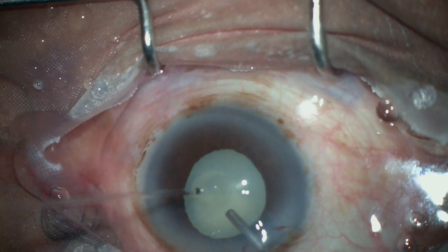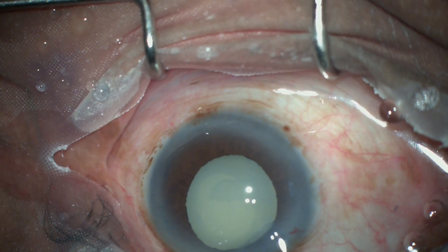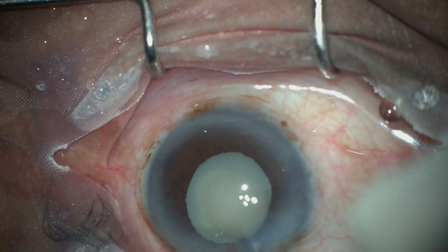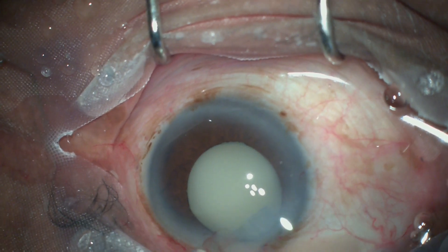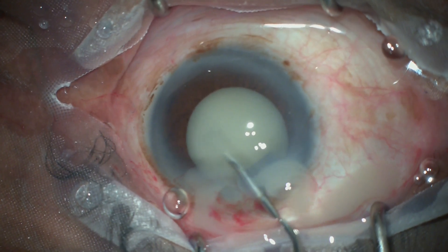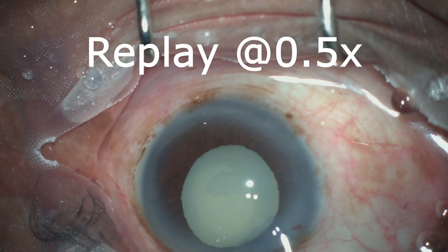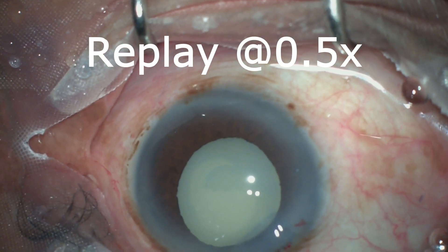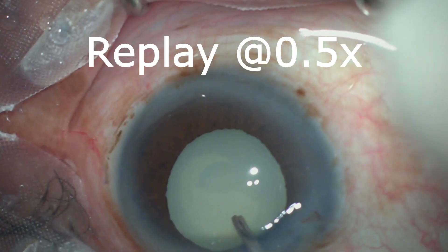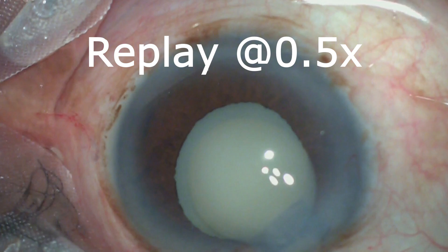Recognizing this as a lamellar capsule, I proceeded to make a nick in the deeper capsule. Once that was done, we can see the cortex leaked out, which should have been the normal scenario. In slow motion, we can appreciate the overlying capsulorhexis stained by trypan blue — that is the superficial lamella — and once we nick the deeper lamella, the liquefied cortex leaks out.